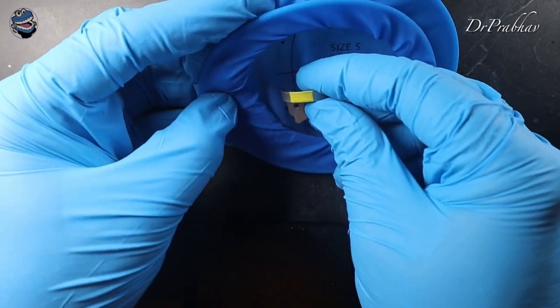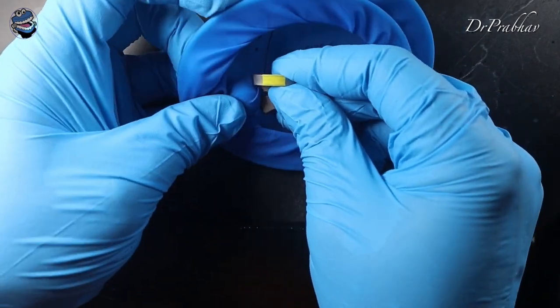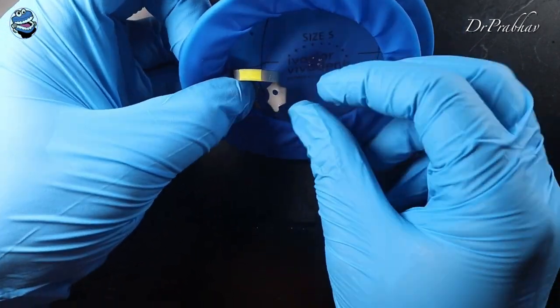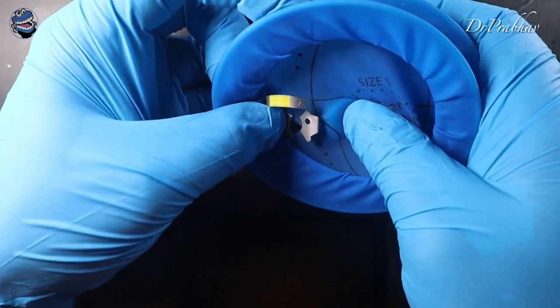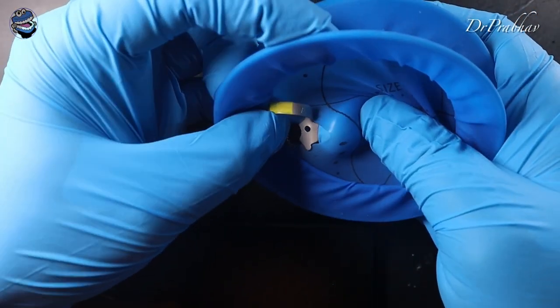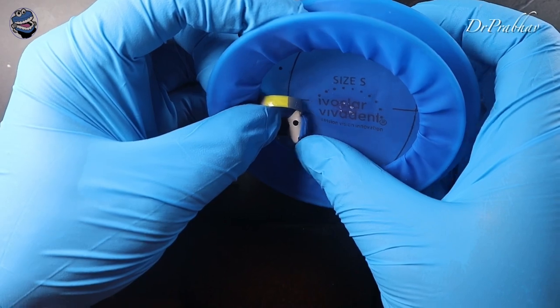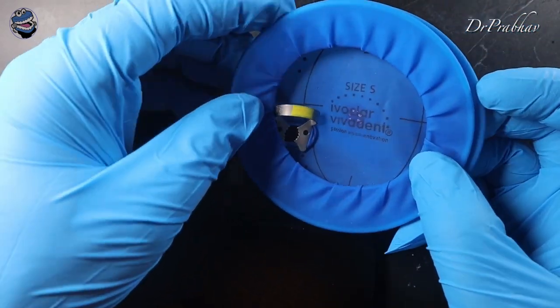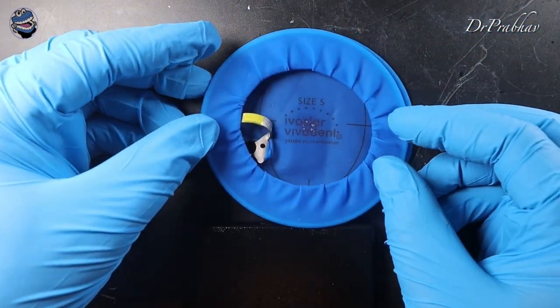We will place the wings of this clamp directly into the punched hole from both sides and get it engaged like this. Once we are done, it becomes a single unit.